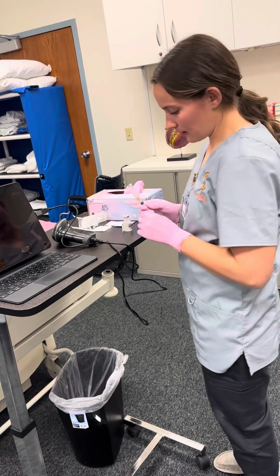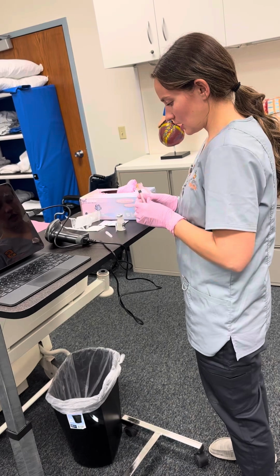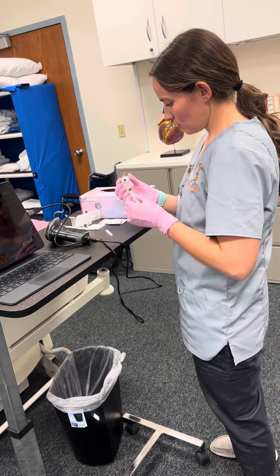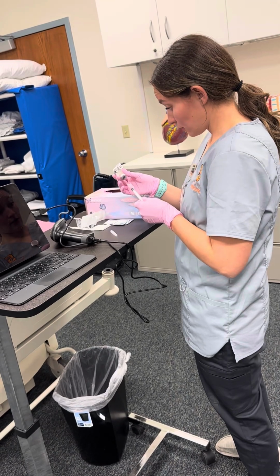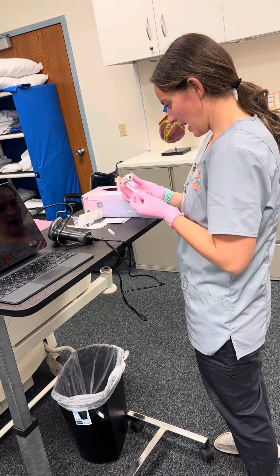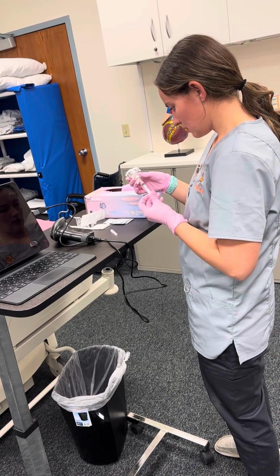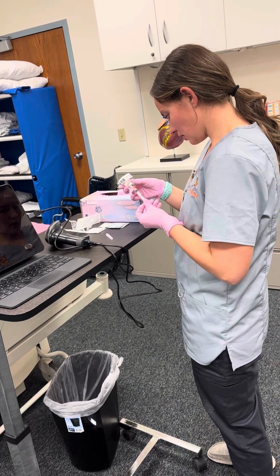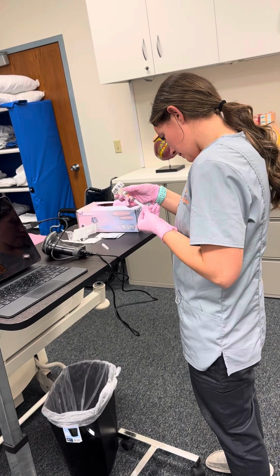This is dried about now, so I'm going to insert this needle into the vial, and first of all, I'm going to pull it out half of a milliliter, poke the vial again, push it, and then get half of a milliliter out. There we go.